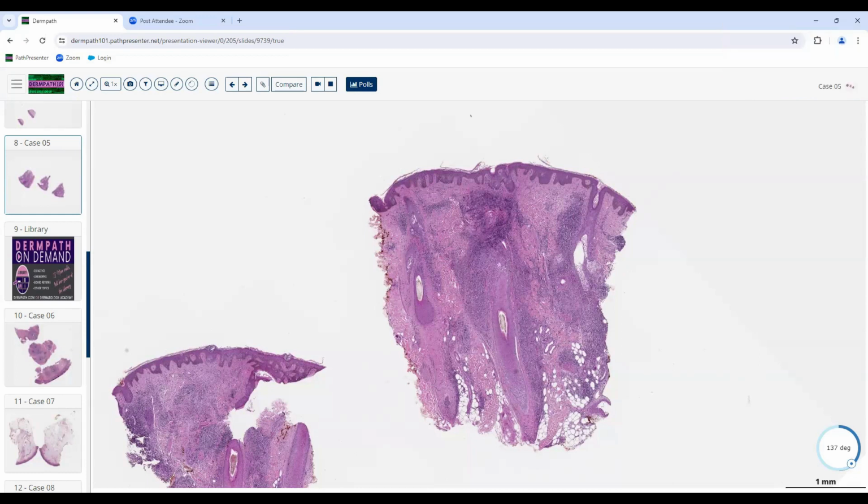It's going to have inflammation in the scalp. There might be some alopecia. Good. Very good. Excellent. Normally we would see about 7 or 8 terminal follicles rooted in the fat. In this biopsy, we only got 1. This one's miniaturized. There's one way up here. There's maybe some areas where there used to be follicles that aren't even there anymore. So yes, this is going to be alopecia, an inflammatory alopecia.